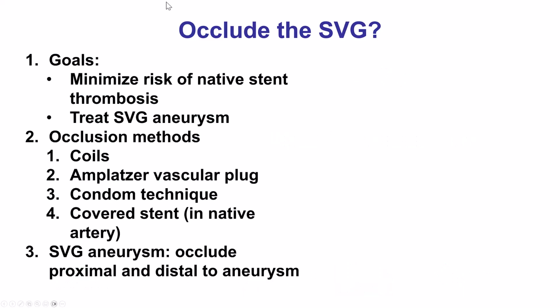There are three components of today's video. The first one is why we're doing it, the second is how to do it, and the third one is the special case of saphenous vein graft aneurysms.